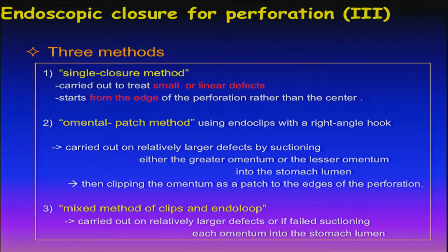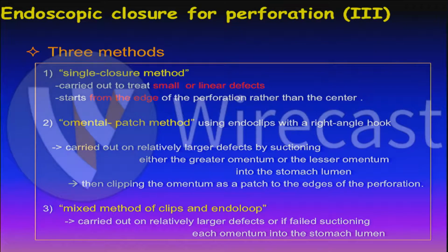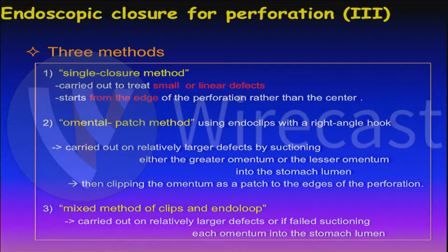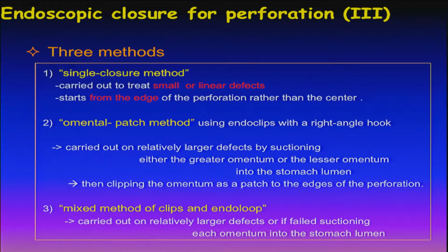I'm gonna divide the three kinds of closure technique. The first is single closure method with the clip. The second technique is omental patch method, and the third one is the clip and endoloop.